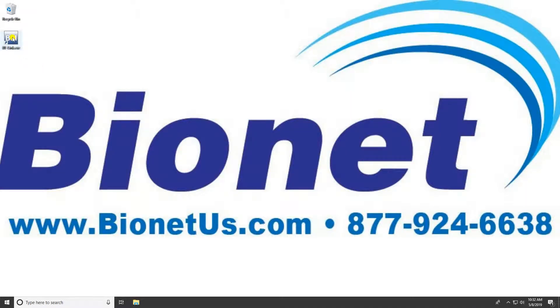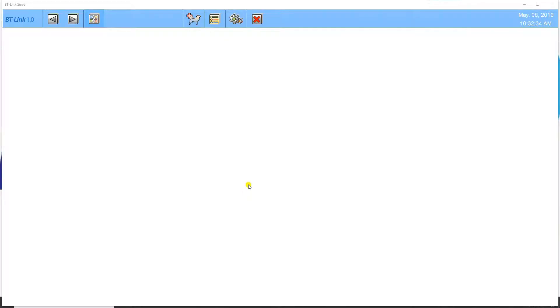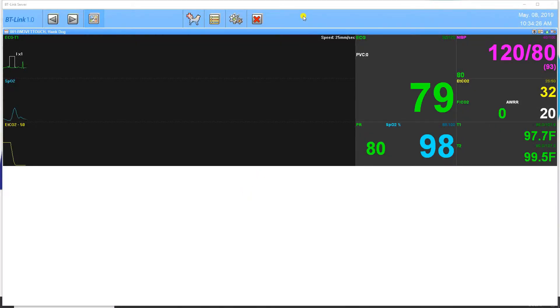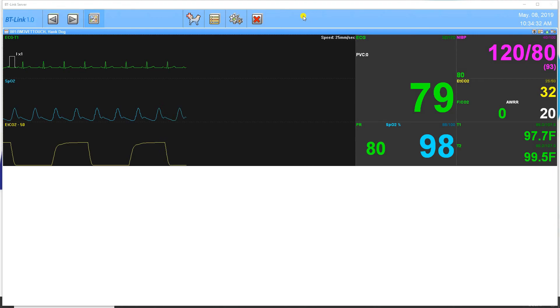On your desktop computer, double-click the BT-Link icon to start the program. Within 10 to 20 seconds, you should see the information from your patient monitor on the screen. You now have successfully connected BT-Link with your Bionet patient monitor.